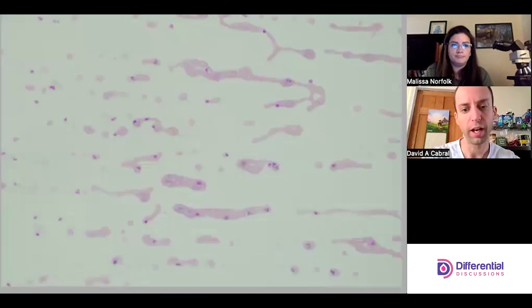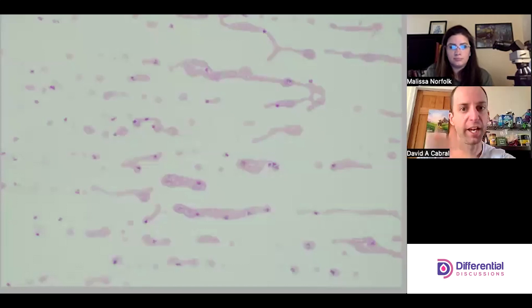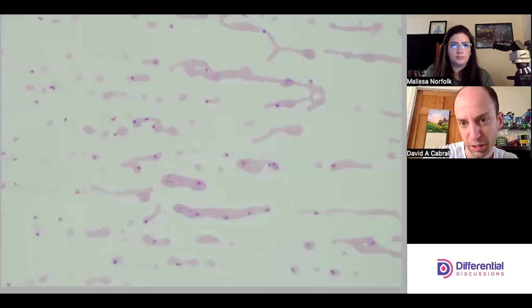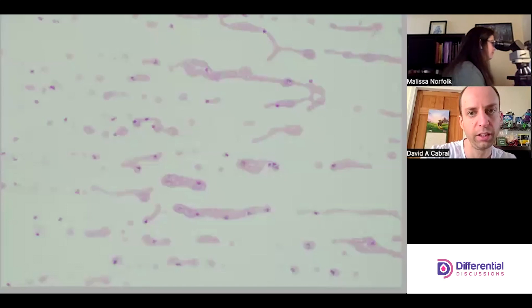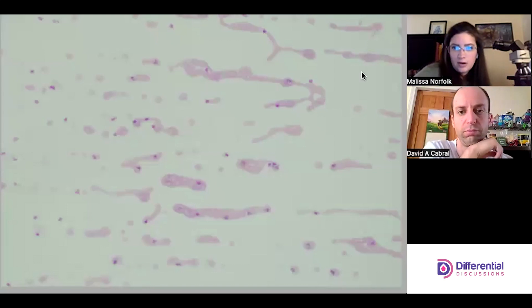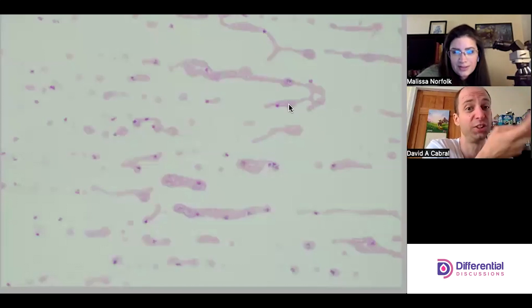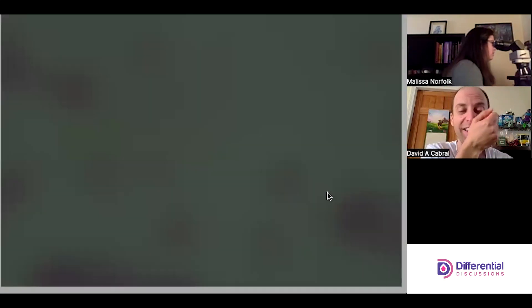Generally, procedurally, we would start evaluating the slide on a lower power and check around the feathered edge and the edges of the slide. So we started on low power — it's kind of tricky to see at 10x — but you can see some clumps here and here. It's way easier eyes on scope. Let's go down to 40x.